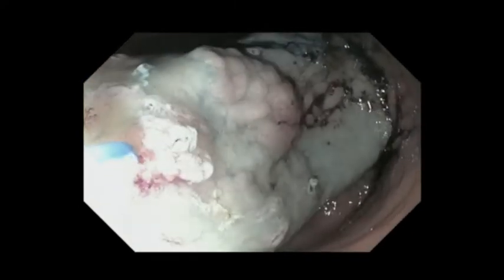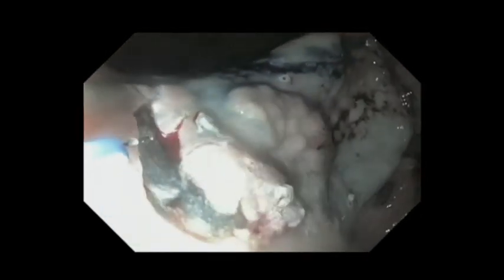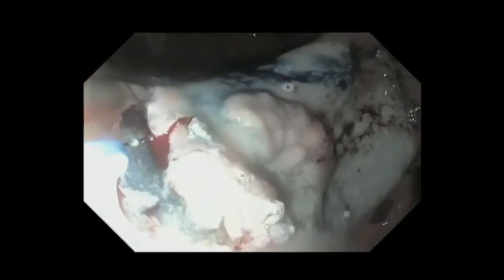We proceed to incise the mucosa with a needle-knife cautery and enter the correct plane for dissection. It is easier to see the plane now that we've injected the blue dye in that space. You will occasionally, even in the correct plane, run into some bleeding, which is easily managed endoscopically.